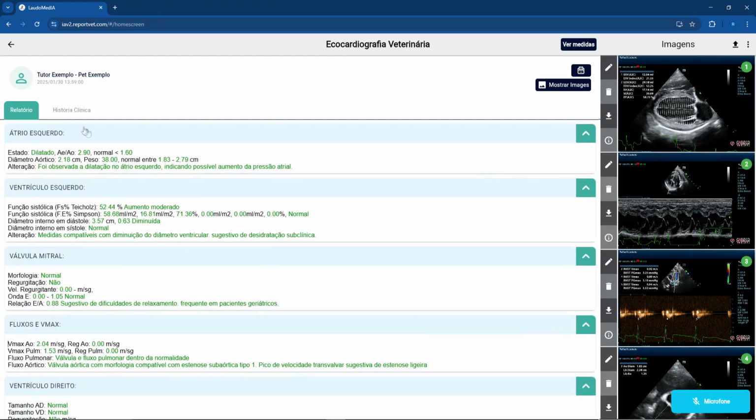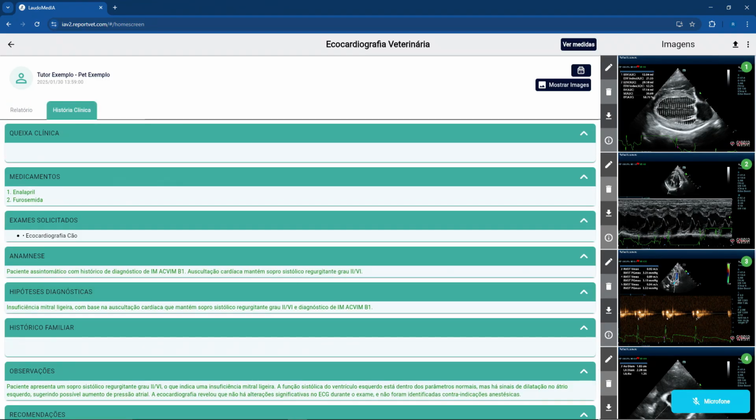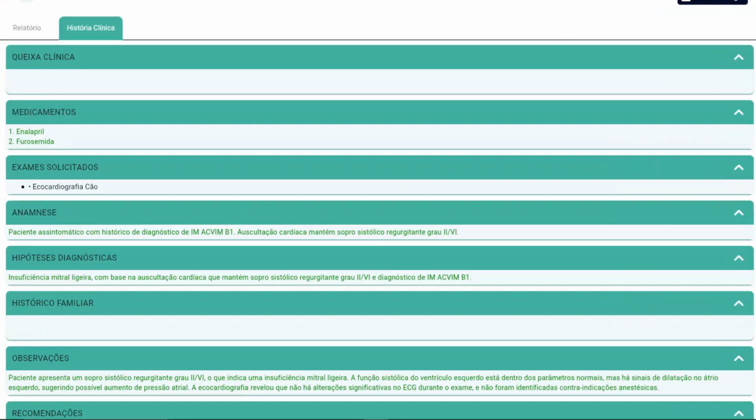We also offer the clinical history section. If a microphone is strategically placed during the consultation, Lumini will understand everything the pet owner and the veterinarian say, automatically filling in the entire clinical history. For example, do you have any clinical complaints or family history regarding your pet? Doctor, my pet's mother died of cancer, and the father has a history of heart problems.